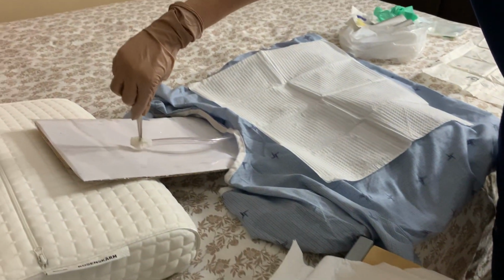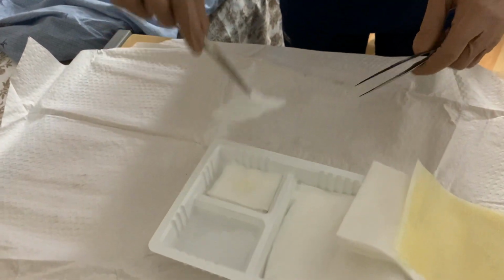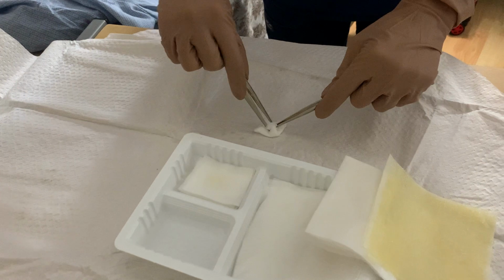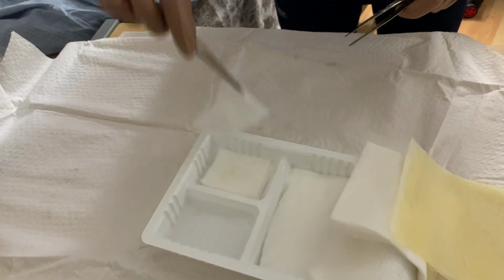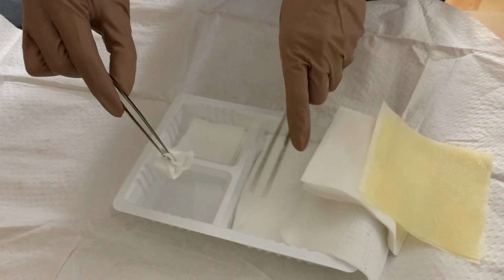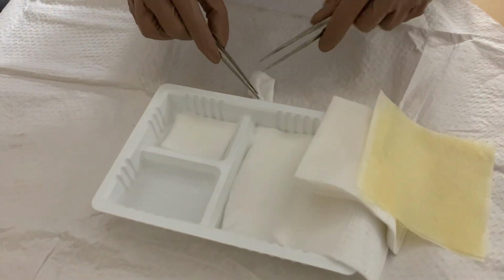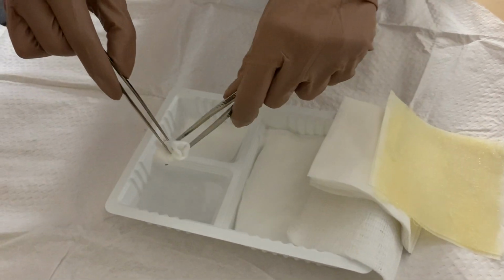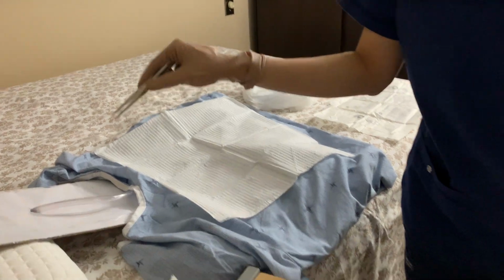Okay, I'm going to be cleaning in a 360 angle, making sure that it is one swipe per wipe. This is just garbage. Again, making a rosette. I'm just going to go back in that area, making sure that I clean it well. Garbage. Now I'm going to clean the outer part. Garbage. Again, I'm going to go back in that area.